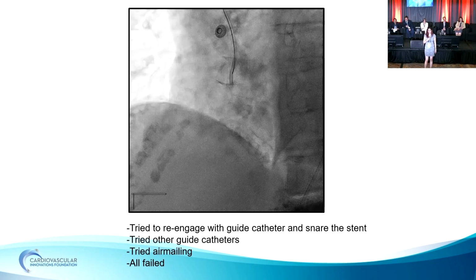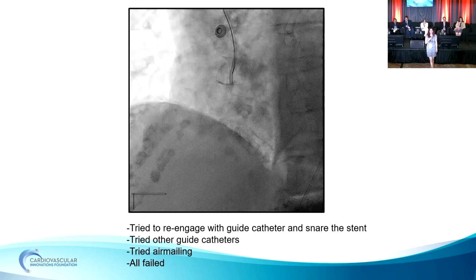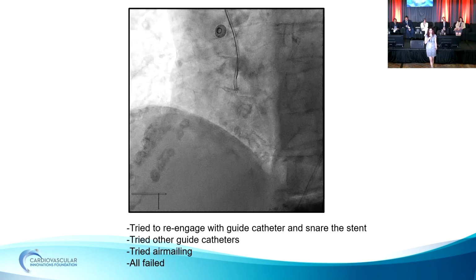So at this point, we tried to re-engage. We tried a couple of other guides, but went back to the AL guide because the others wouldn't even sit.